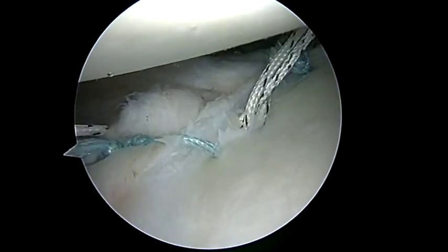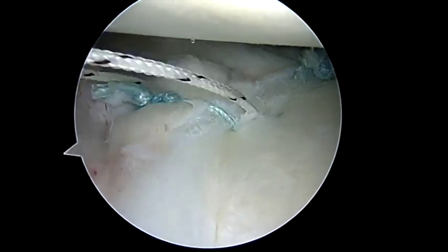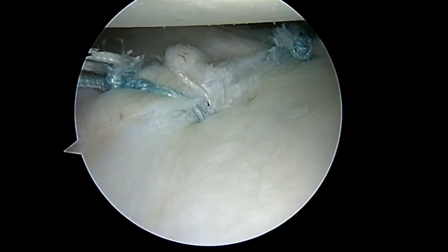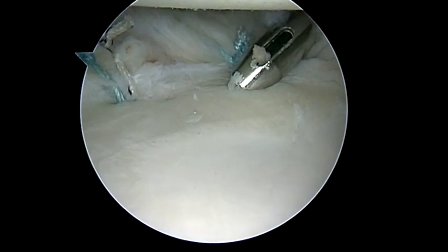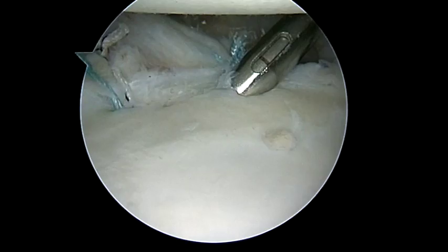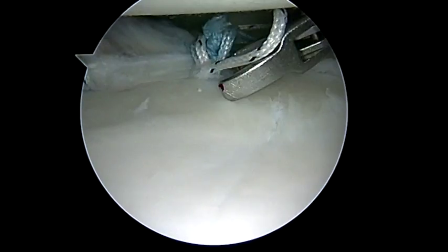The process is then repeated with the TigerWire suture. We prefer alternating half hitches for our arthroscopic knot technique. A second anchor is then placed through the subscapularis tendon approximately 7 to 10 millimeters more anterior on the glenoid face.